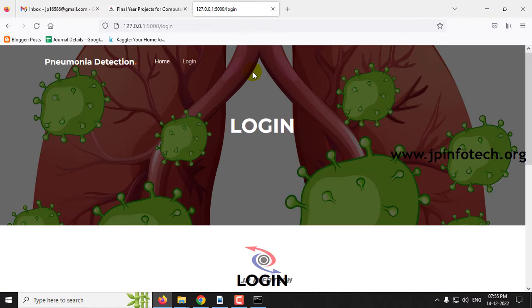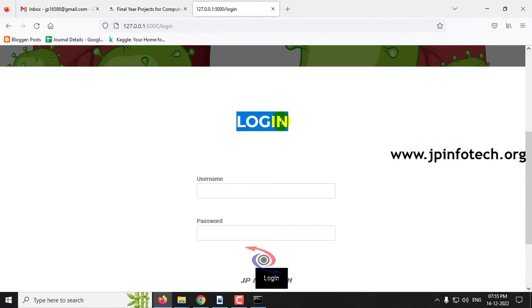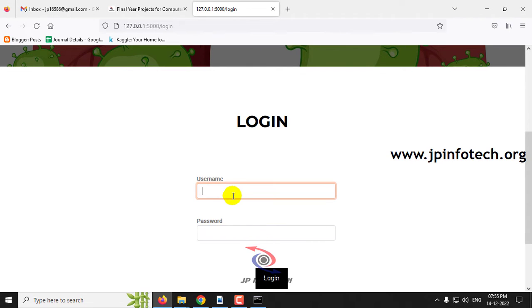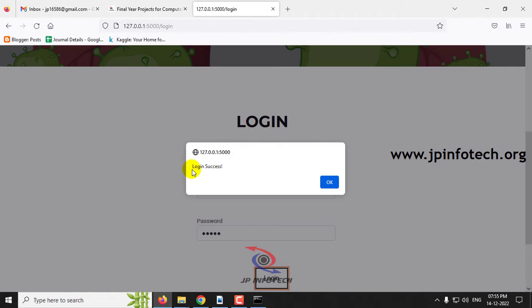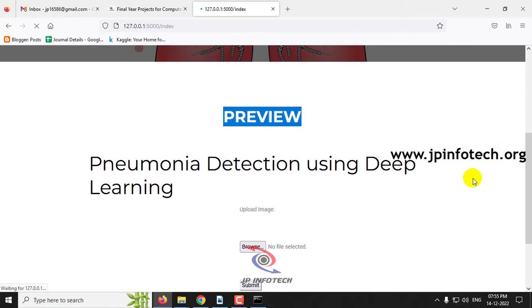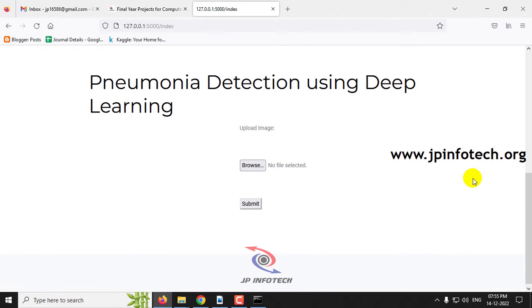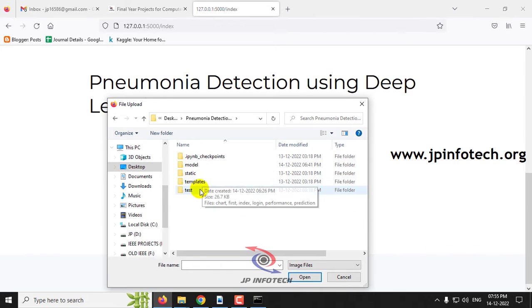Now you can see the home screen with the project title Pneumonia Detection Using Deep Learning. Click the Login menu and it will navigate to the login page where you can see username and password fields. Note that this is a static login page because we have not used any database in the project. Enter the username and password as 'admin' and 'admin', then click the Login button.